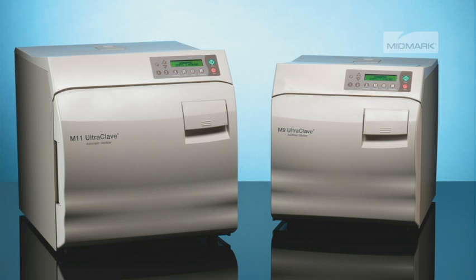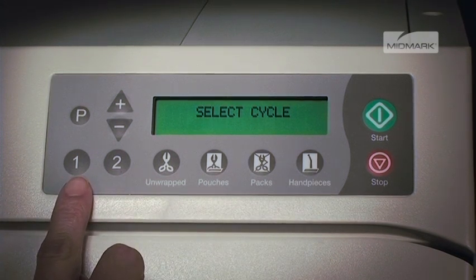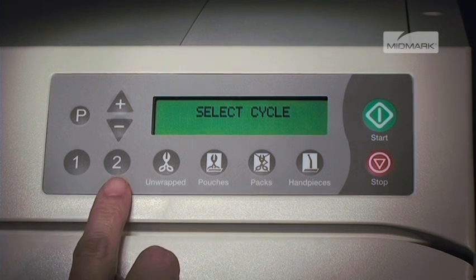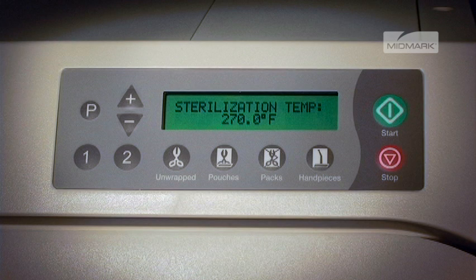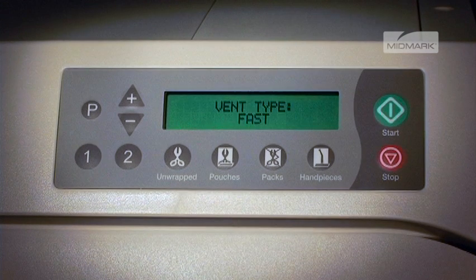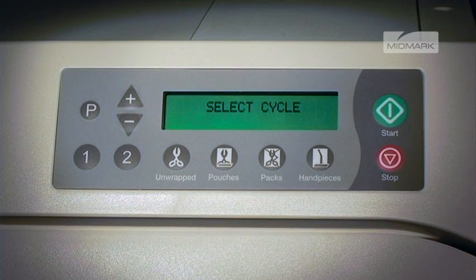To program one of the two programmable cycles, select either the one or two button on the control panel and follow the prompts on the unit display to set the desired sterilizing temperature, sterilizing time, vent type, and amount of drying time. For this example, we'll use Program 1.